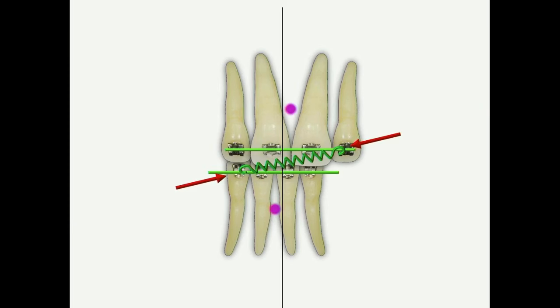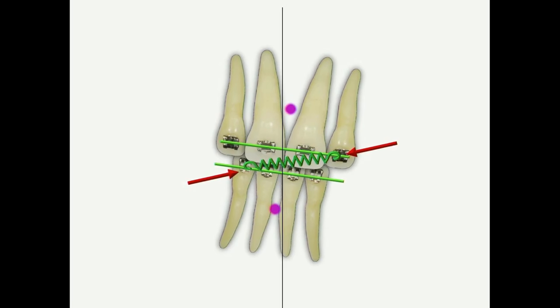It is our contention that the use of these intermaxillary mechanics with elastic will create more problems than they solve. Although the midline is moving in a desirable manner, we should notice that the occlusal plane canting is produced in the frontal view as an inevitable side effect.